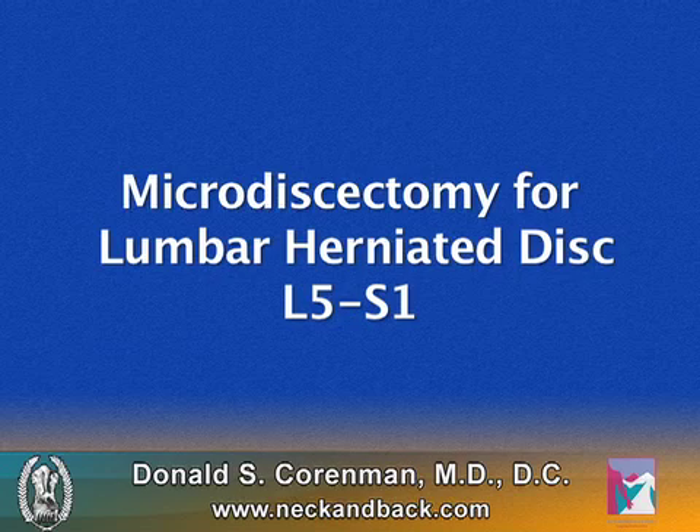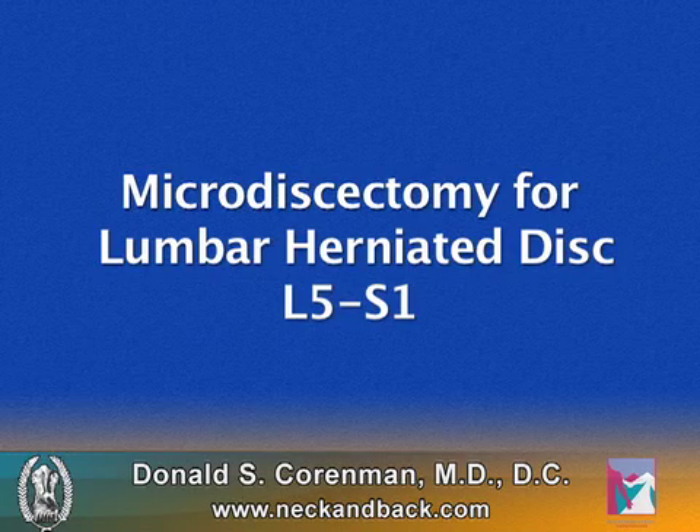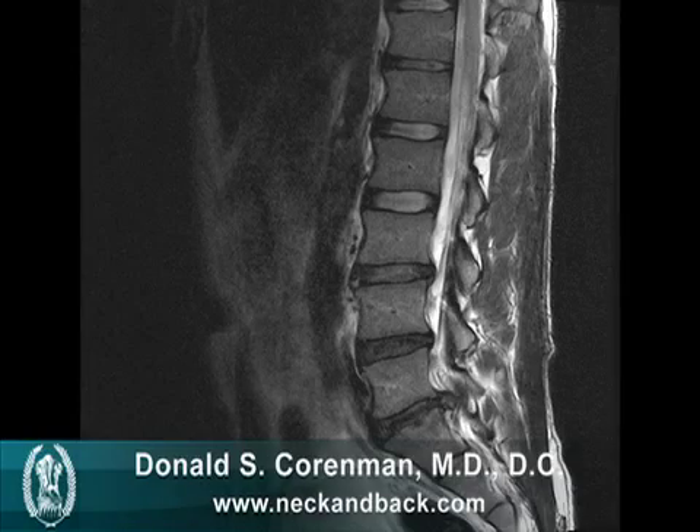Hello, this is Dr. Donald Kornman. We're going to view a video of a microdiscectomy of a lumbar herniated disc at L5S1, the lowest level in the lumbar spine.